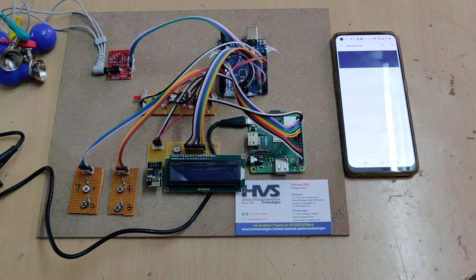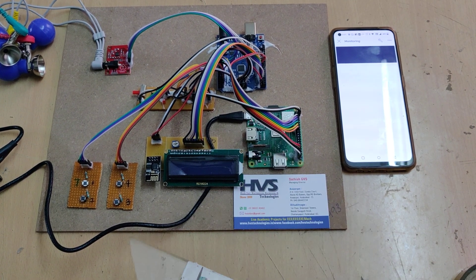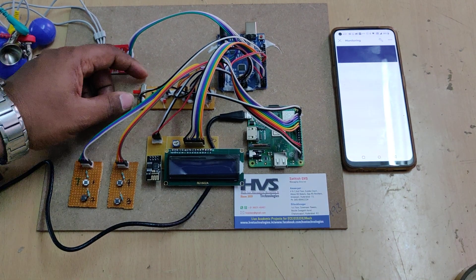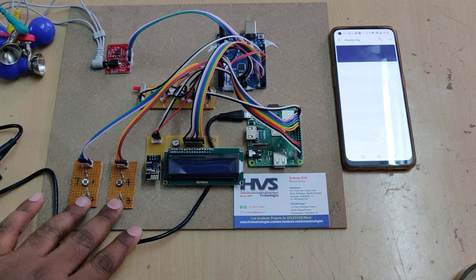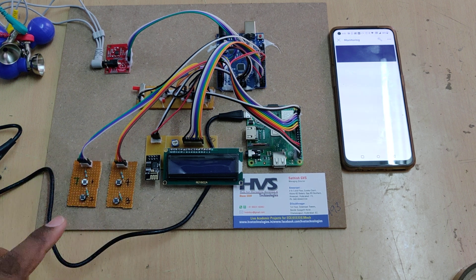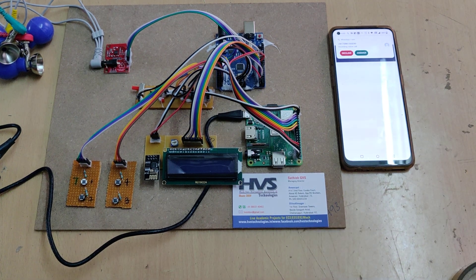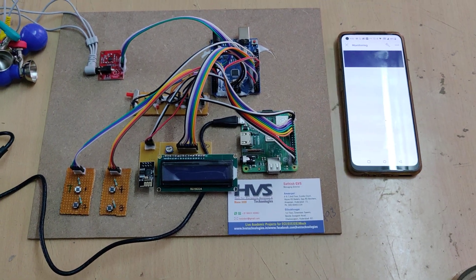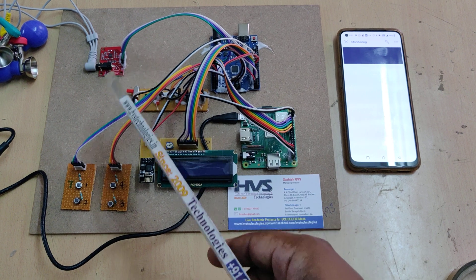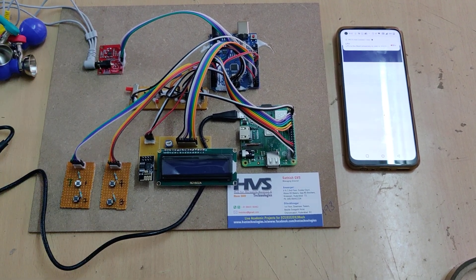The Arduino Uno board is interfaced between the sensor module and Raspberry Pi 3. There is also a manual dataset mode. Using the four control buttons, we can select a dataset, and based on the data selection the system will predict the disease if it matches with that dataset. Then we can send a message to the Blynk application. In manual mode it uses dataset mode, and in auto mode it uses the ECG data directly.